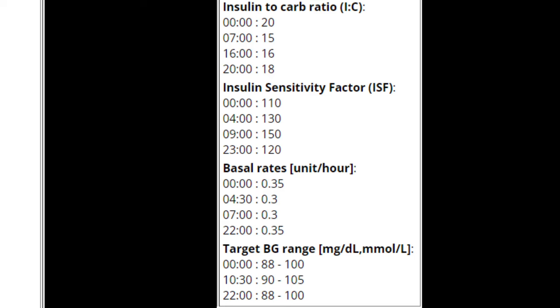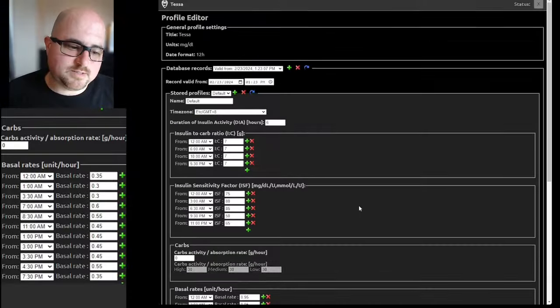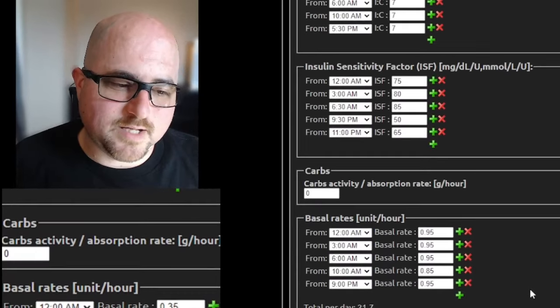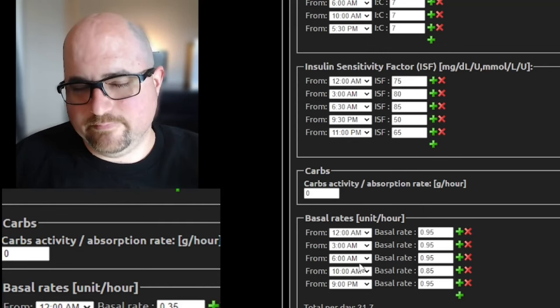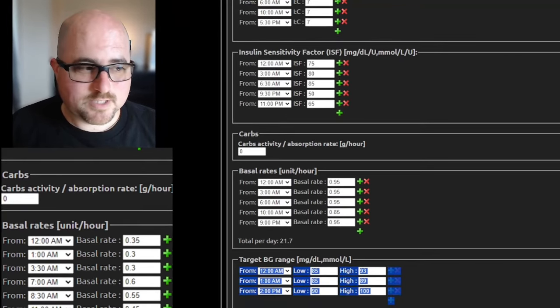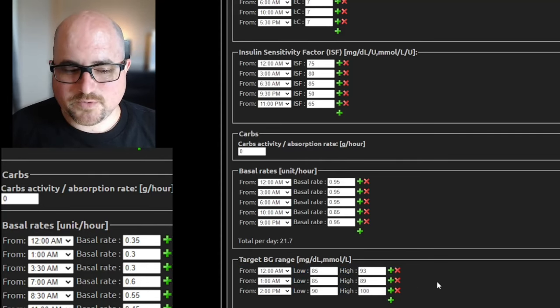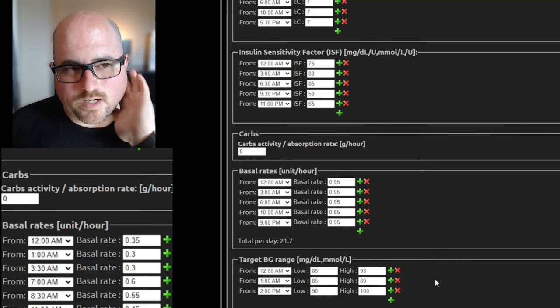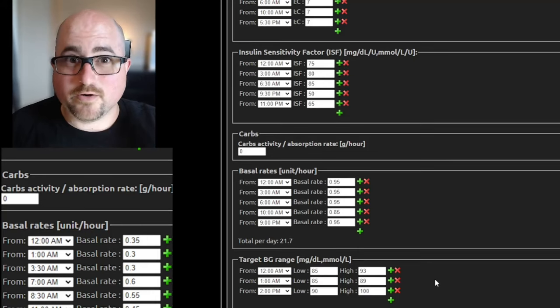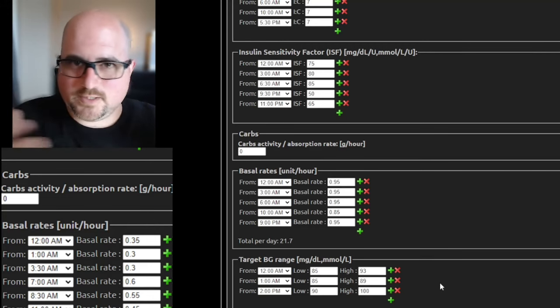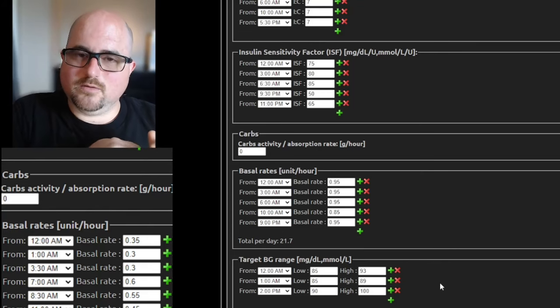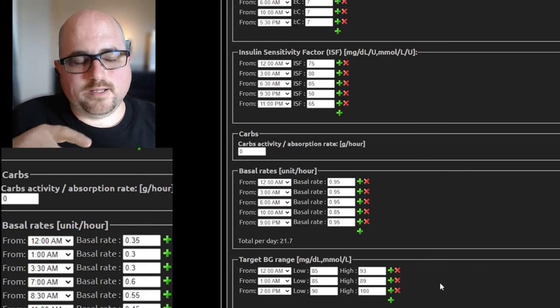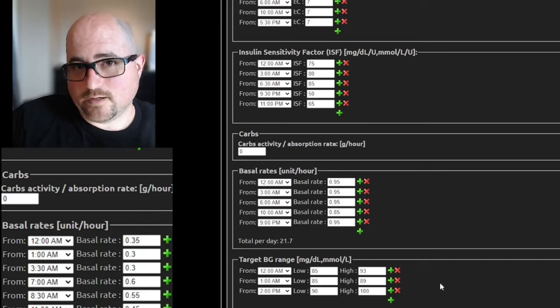Same with the basal rates — I tend to keep it simple. I'll just show you Tessa's. So this is Tessa's basal rates — really just a couple of slots, like five. Nighttime: I have 9 PM to midnight. Sometimes I add like an 11 PM slot, then midnight to 3, 3 to 6, and then she's basically awake. Same with the correction ranges. You have a lot of correction ranges, and what I explained in the comment recently is that it's not doing probably what you think it is. You might want to watch the video on the YouTube channel called 'How the Loop Algorithm Works.' It talks about how the correction range gives Loop permission to dose, and how it acts on the predictions based on the range you define.